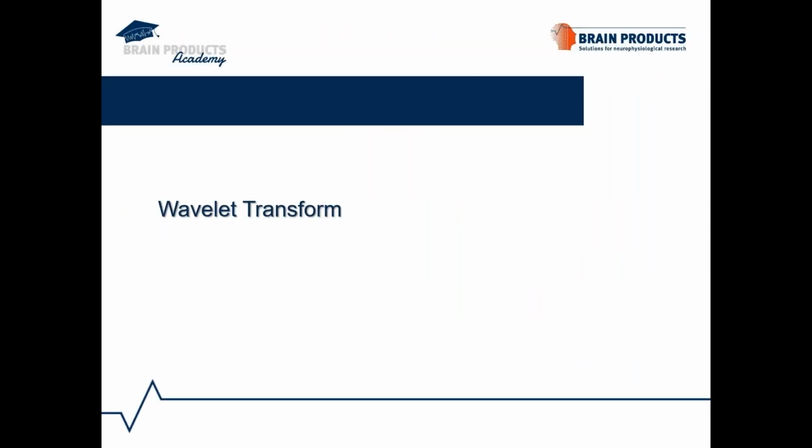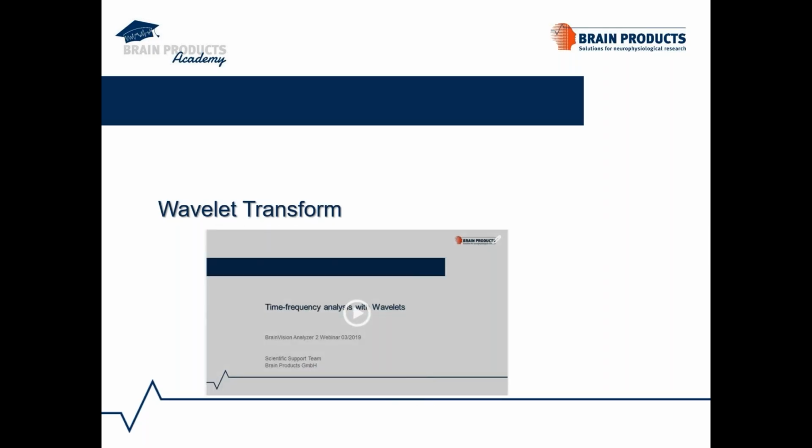Let's start with Wavelet Transform. This method is no doubt a widely used time frequency decomposition method in various areas of EEG signal or EEG research. Same as FFT, we also have a dedicated webinar video for Wavelet Transform, where you can get the detailed information and mathematical descriptions. So in the following slides, I will give you a general overview of the method.